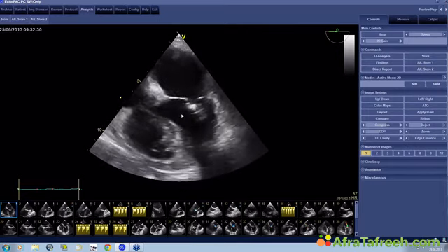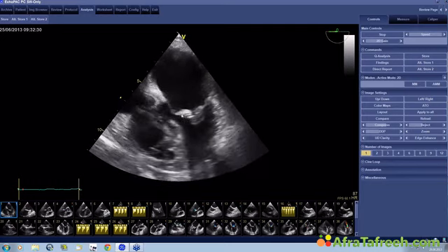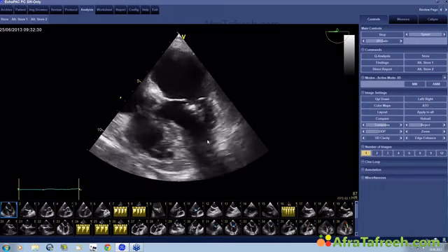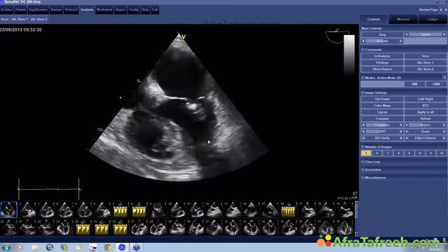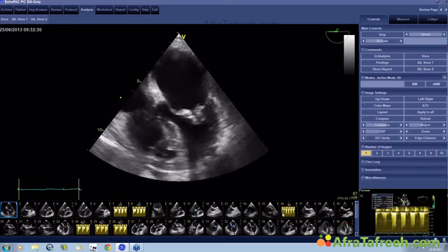In this case, we also use TE, simply for the reason that I explained before: we thought the valve is maybe not the ideal valve to look at. And when these patients are on the table and they don't have such good image quality to start out with, it's probably a good idea to have a probe inside and to do the whole thing under anesthesia and have the patient monitored by TE.